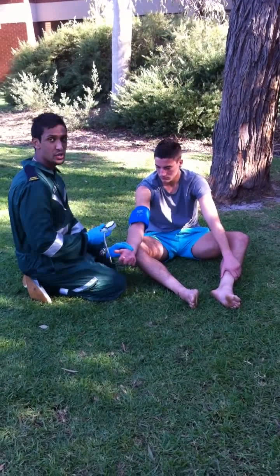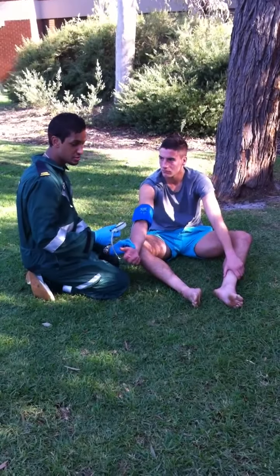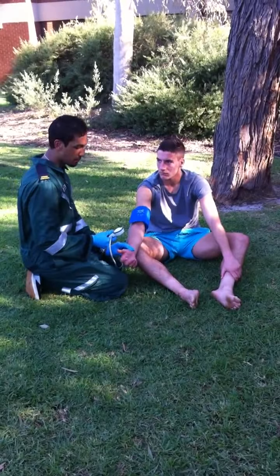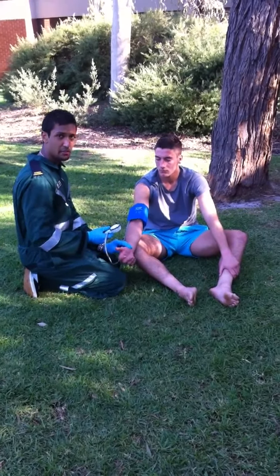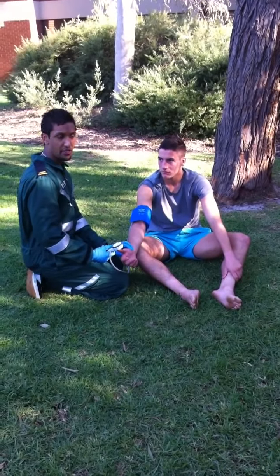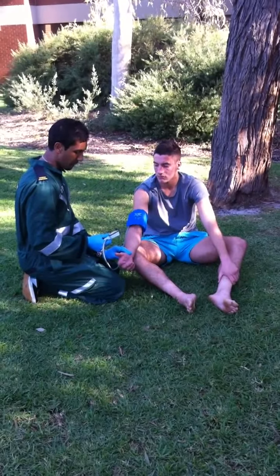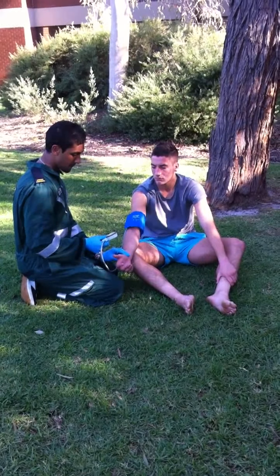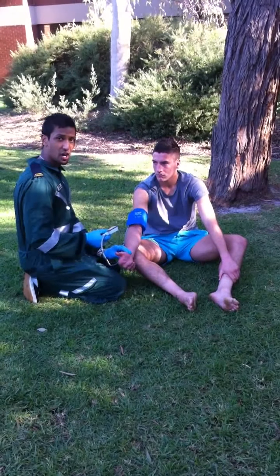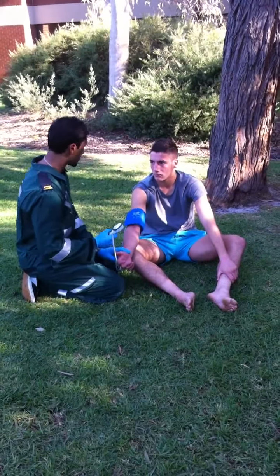I'm just palpating Mr. Jones's blood pressure to find a systolic blood pressure. I'm placing my fingers on his wrist to gain a systolic blood pressure reading. I pumped it up to about 30 above what I think it might be, and as soon as I feel a throbbing sensation, I'll take his systolic blood pressure. So I've got a reading of about 90. So Mr. Jones, your systolic blood pressure is about 90.